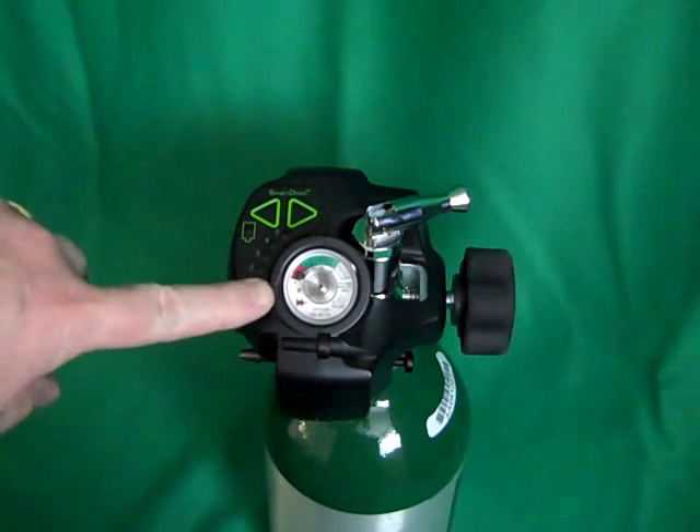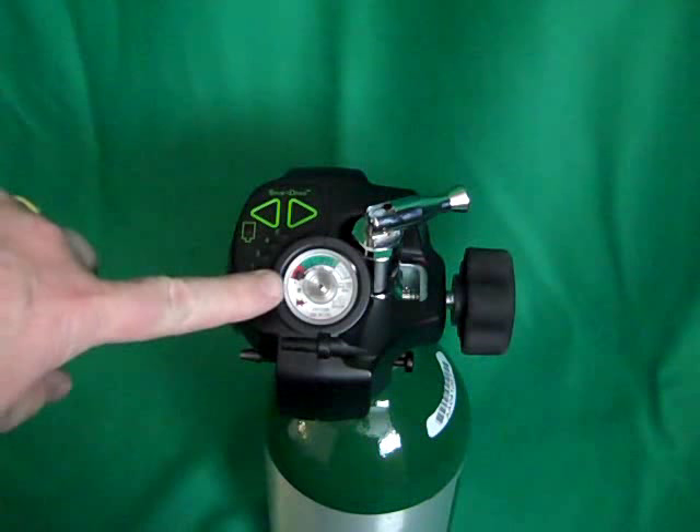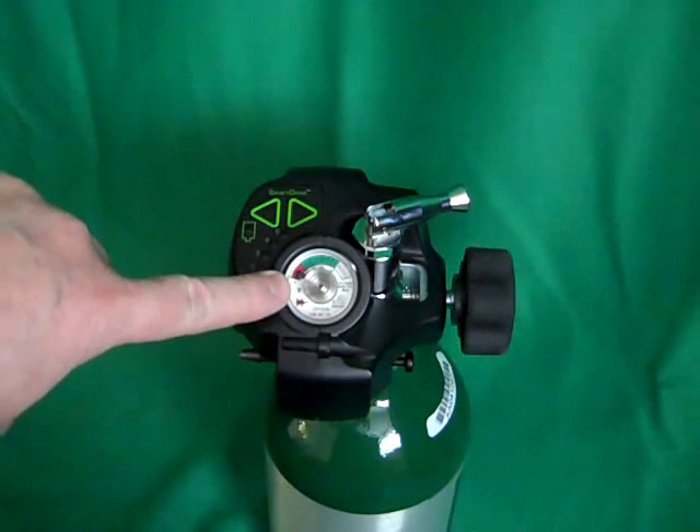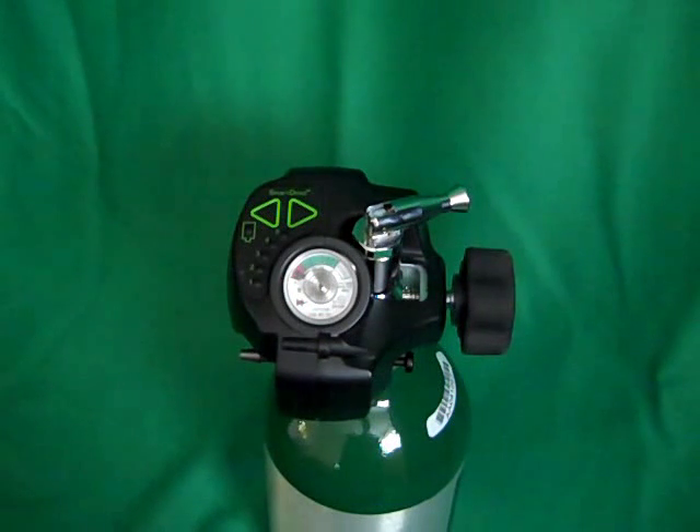The SmartDose Mini is equipped with a contents gauge that shows how much oxygen is in the cylinder. It is a simple green-red gauge to indicate how much gas is in the cylinder. Do not operate SmartDose into the red ranges as the pressure is too low and the pulse size will be reduced.